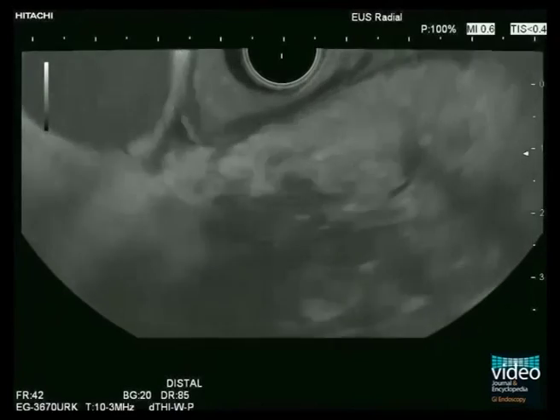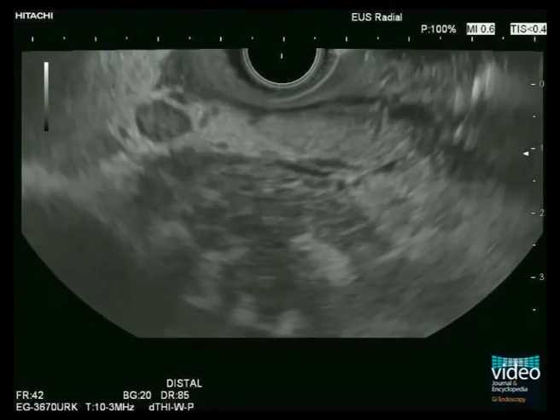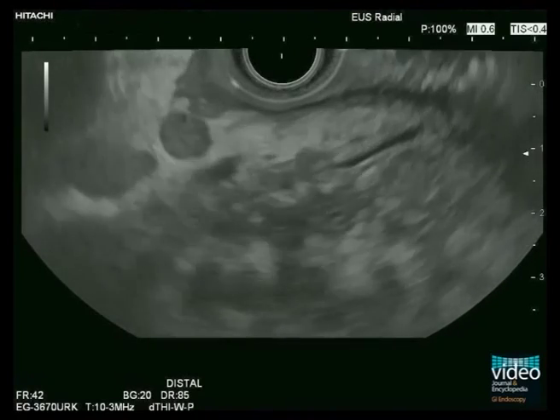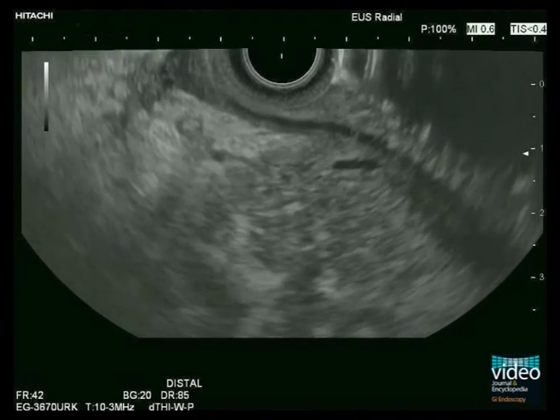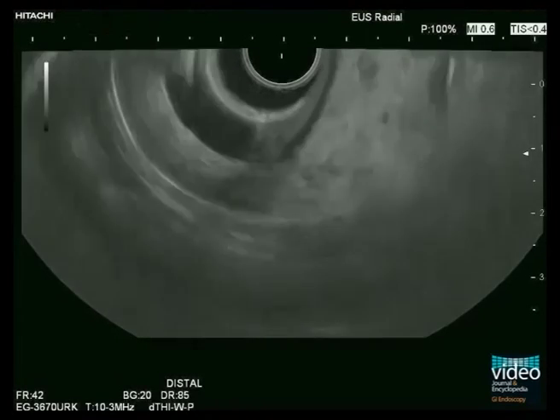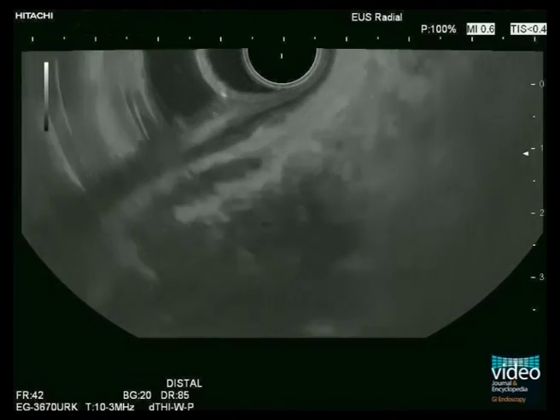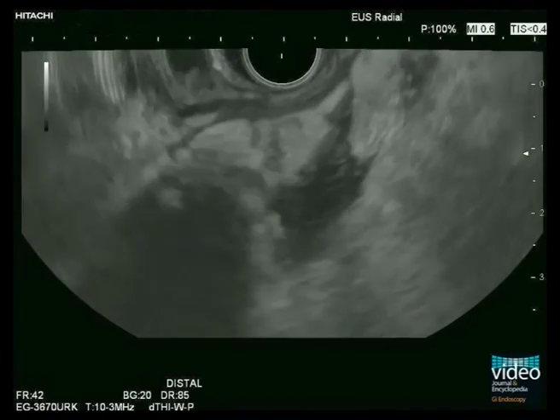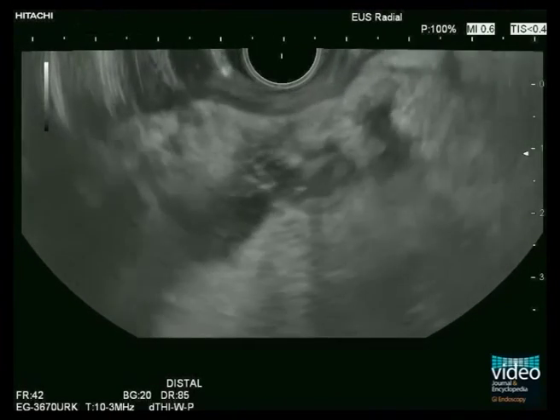This is a male patient with severe biliary pancreatitis. Hypoechoic lymph nodes are shown in the vicinity of the ill-defined pancreatic gland. We find confluent areas of hypoechoic peripancreatic fluid as well as hypoechoic areas in the pancreatic head and body. Near the papilla, the pancreatic head is compressed by edema and inflammation.